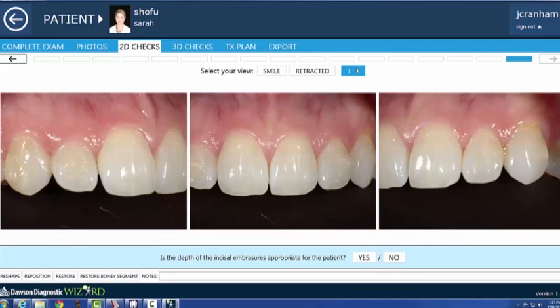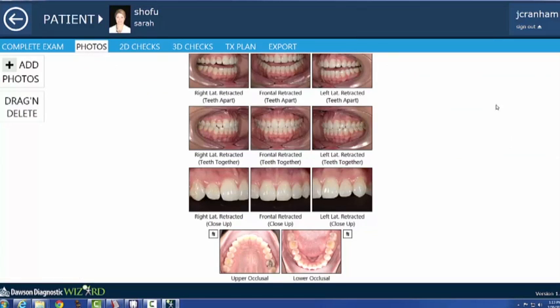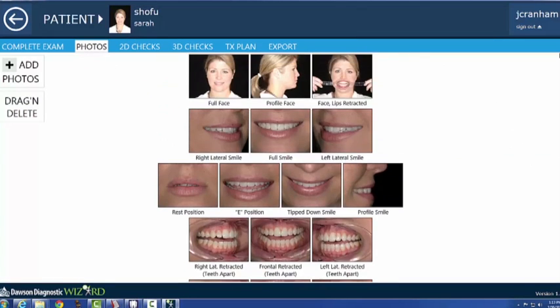So just in a nutshell, what I want to reiterate is that there is definitely a reason we take these pictures, but if we don't take them properly, they are not diagnostic. If we don't take them properly, often with editing software, we can't fix them. So the more that we take the extra few minutes to get the patient positioned right, the doctor positioned right, the camera set right, then we can fly through these pictures and get really good ones.